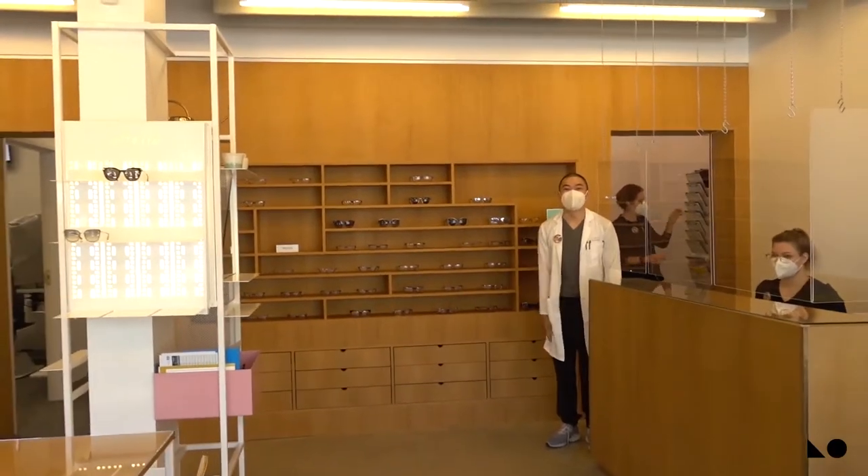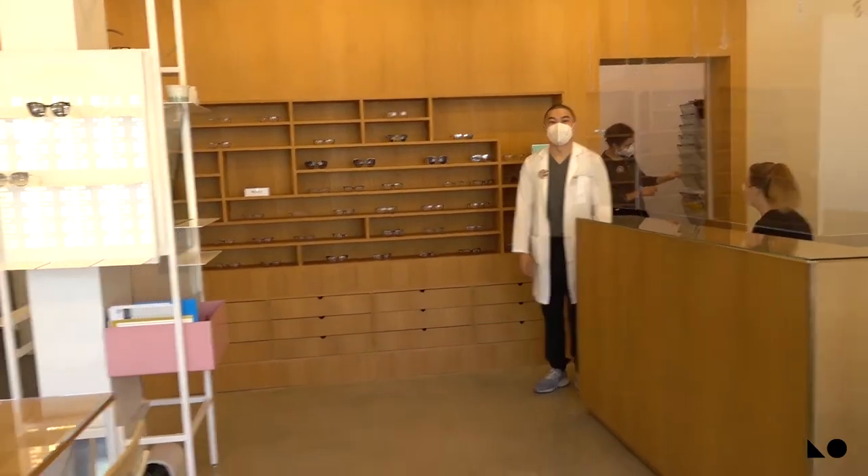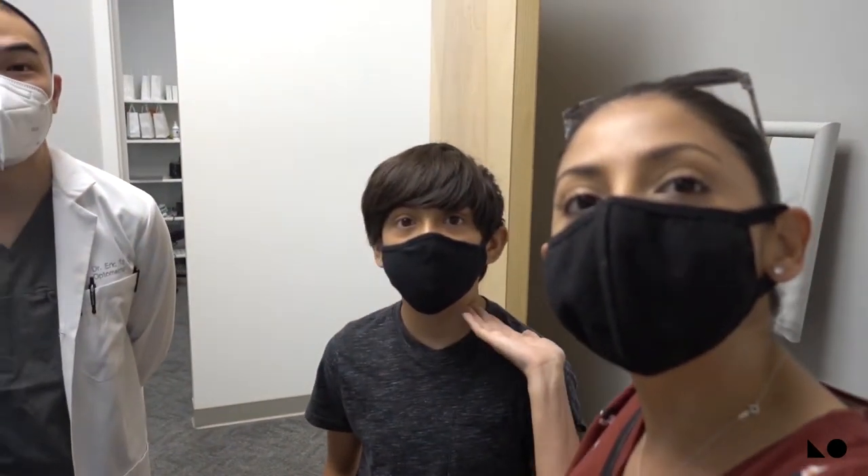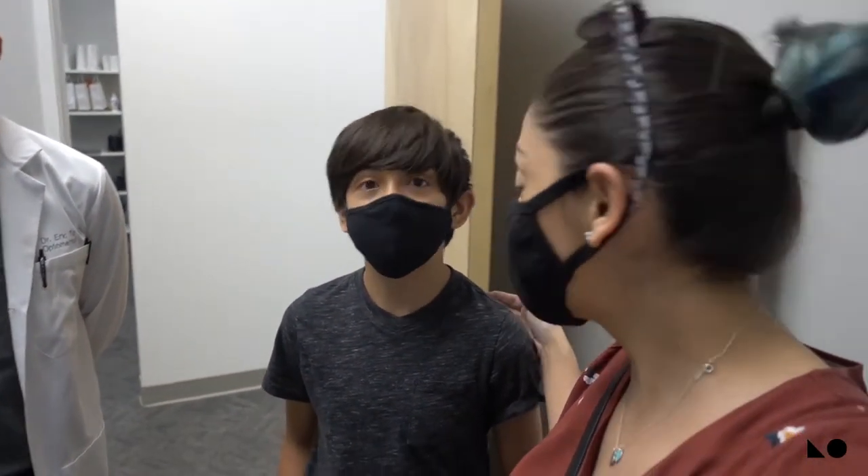Hey, hi doctor! How are you? You ready to get those lenses checked? So this is Dr. Eric Toh here at Lumen Optometric, and he's gonna be talking to us about Isaac's lenses.